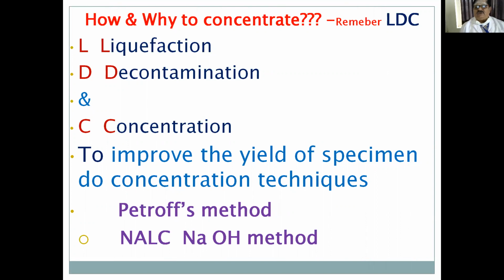How and why to concentrate? Because you heard of concentration techniques in the earlier class. But why and how? The how part, remember LDC: L is liquefaction, D is decontamination, C is concentration. And why to concentrate? To improve the yield of the specimen.